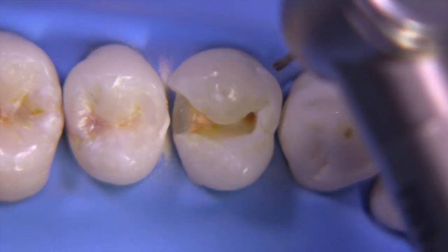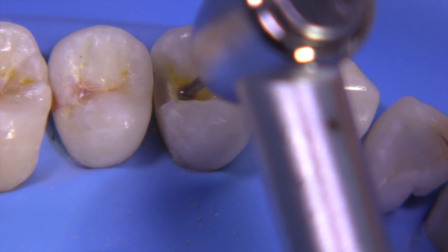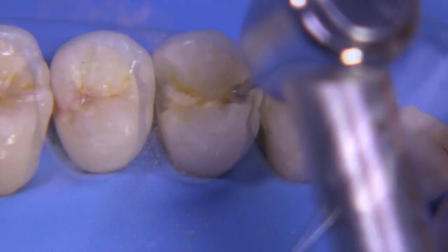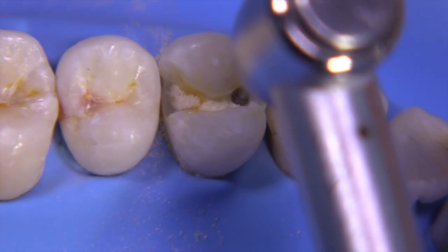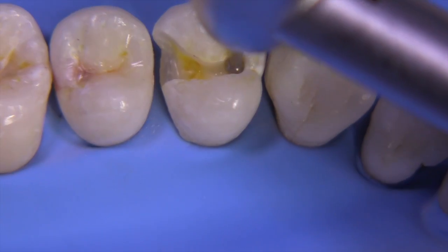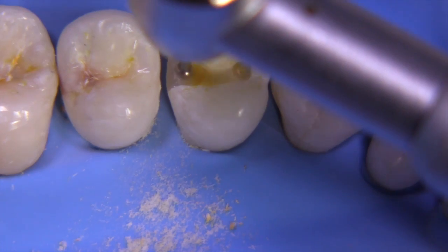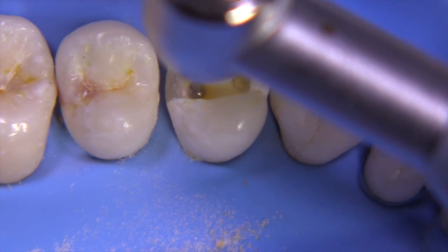That little bump on the lingual needs to be rounded off — this leads to a slight overextension on the lingual, but that's common on maxillary premolars and not usually an issue. Let's remove some caries with the 4-round burr at slow speed. The key with caries removal is to get the DEJ and the enamel as clean as possible — we don't like to leave any stains or demineralizations in the enamel or dentin, particularly near the DEJ. In this case the caries was not so deep pulpally or axially so we removed almost all of it.